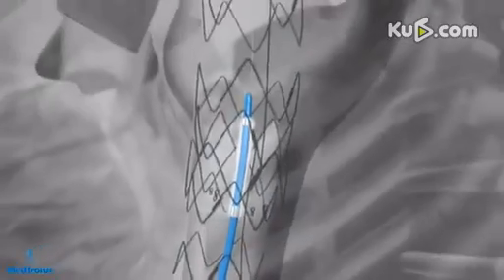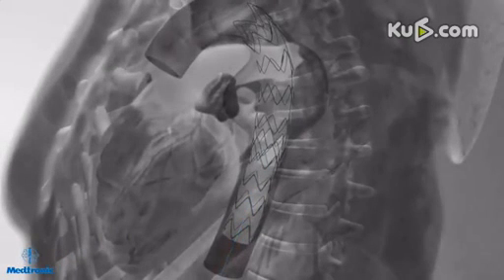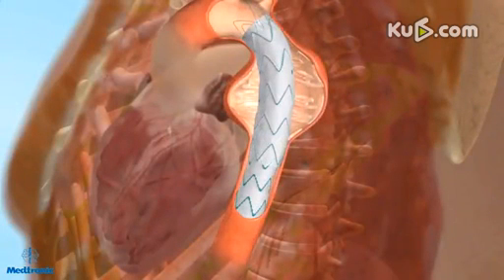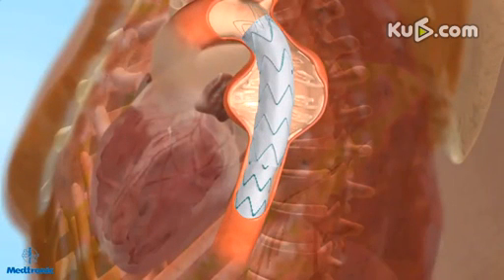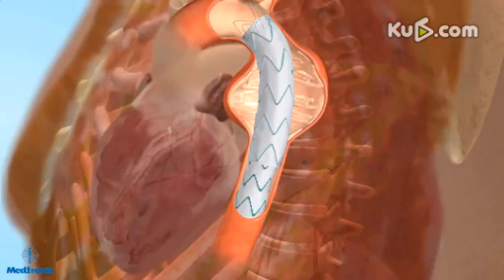Remove the delivery system and model the stent graft to the vessel wall. Upon completion of the final ballooning procedure, perform angiography to verify stent graft position and sealing and the absence of endoleak. Remove all remaining accessories such as guide wire, introducer sheath, and angiography catheter. Close the arteriotomy site by standard surgical closure techniques. The Talent Thoracic StentGraft deployment is complete.